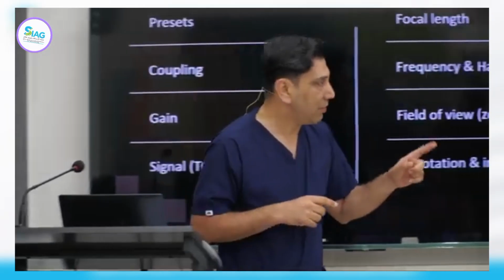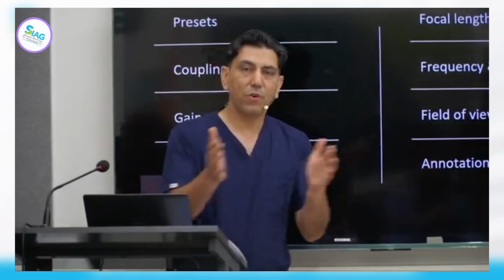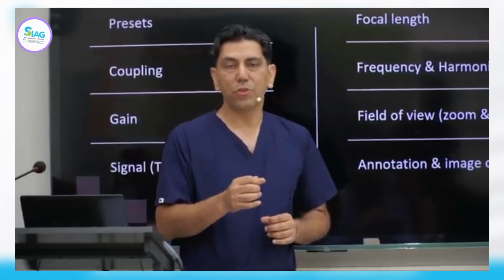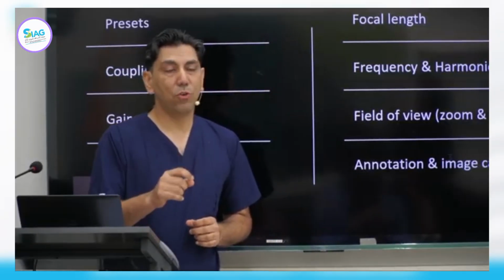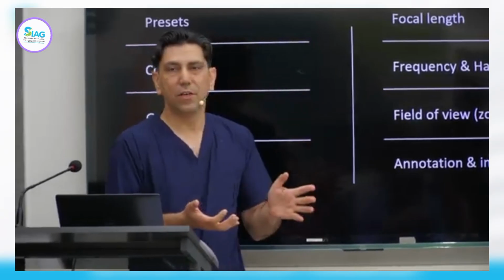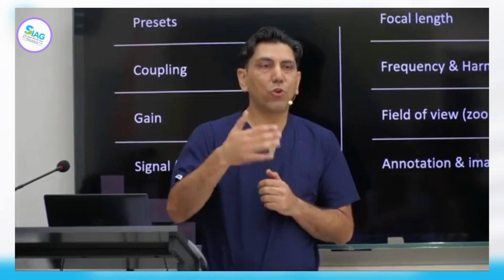And one last thing, which is probably very important: 2D images, static images. If you can record videos or loops, if you are in your tumor board or MDT, you can replay those and present them. But if you're just taking static images, what you want to do is take images and then annotate those images. For the benefit of records, for the benefit of documentation, it's a medical record, it's a legal document at the end of the day. So that it makes sense whoever then looks at the images, they may or may not be there. They may just be seeing a static image, not knowing where the probe is.